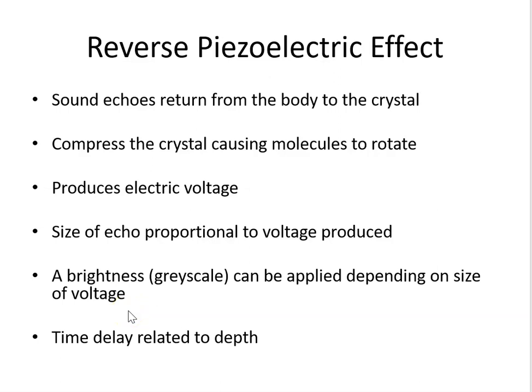And this image is built up by the time delay, because we know how long it's taken for a particular detector, a particular piezoelectric crystal, to fire. That sound enters the body, that sound comes back maybe as a series of echoes, and then that is converted to voltage, and that's converted to an image.